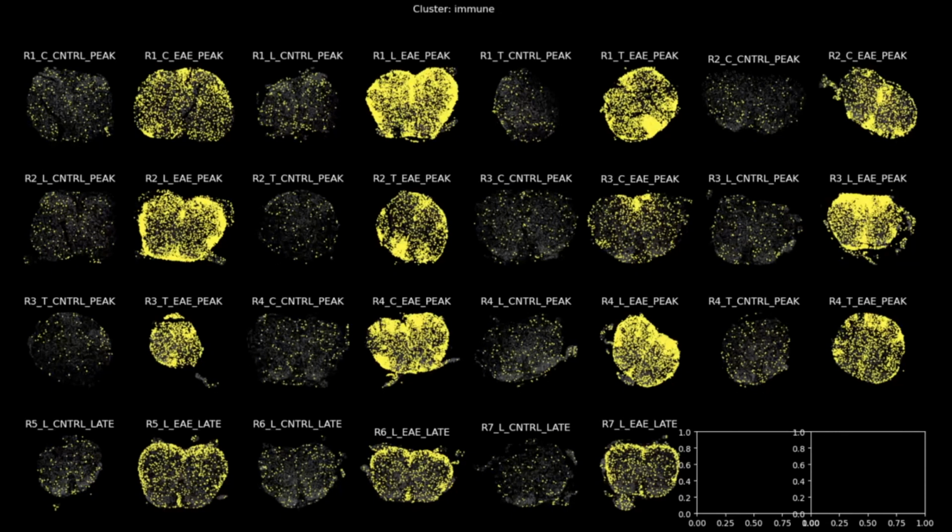And then we of course also have the exact spatial location of each of these single cells, so that we can start to look at neighborhoods of each cell to make sense of how these lesions are comprised and what biological processes are happening.